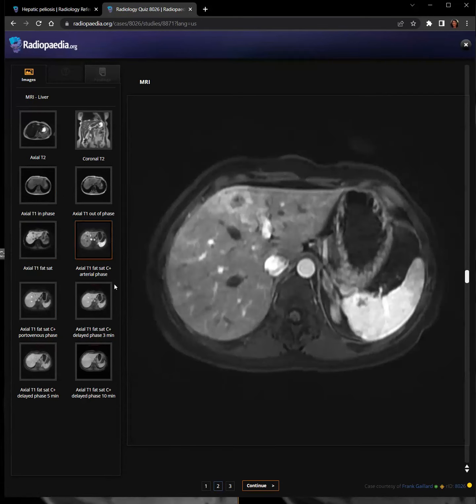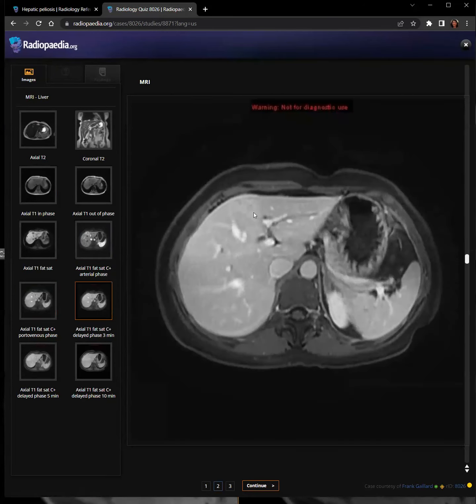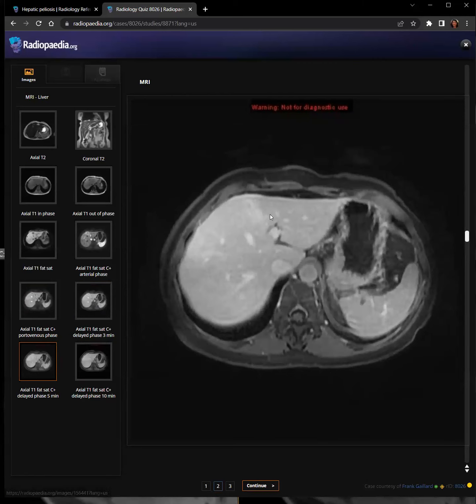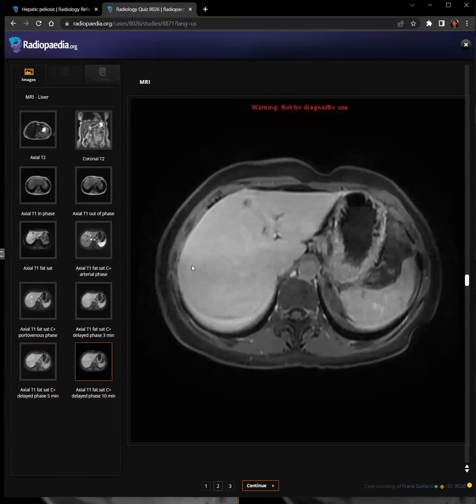Here's your... I don't know. I don't think this is inside out either. This is really outside in, if anything, unless I misread the paper.